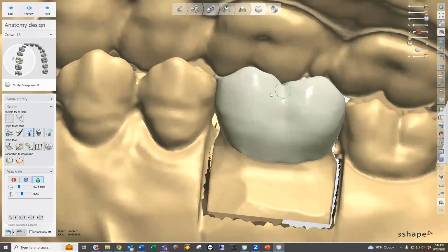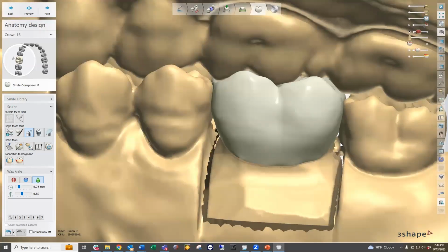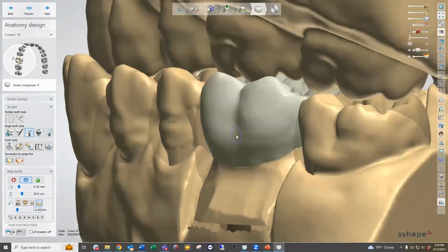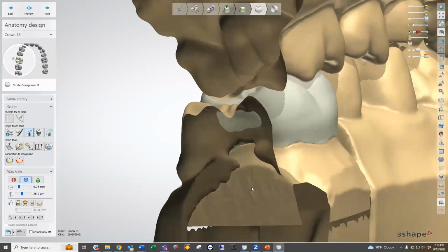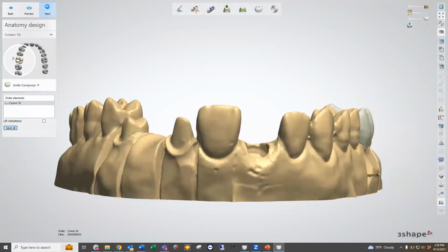And we also know that we have nice broad contacts with our interproximals because we set that predetermined amount in our wax knife tool on this option here. We set that to a negative amount, which allows us to encroach upon those interproximals, a positive amount into there, so it seats positively. Okay. So once we have all that determined and everything looks good and you're happy with this design, we can go ahead and move next, and we finalized our design.